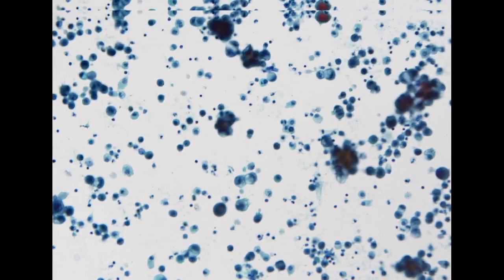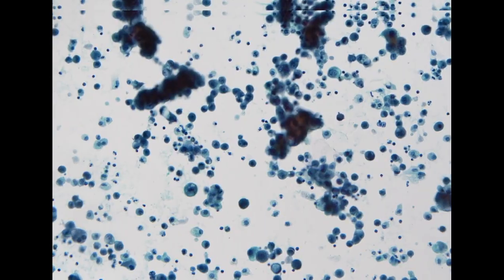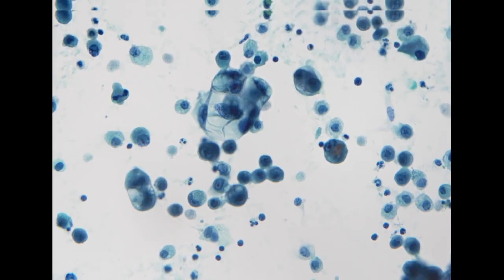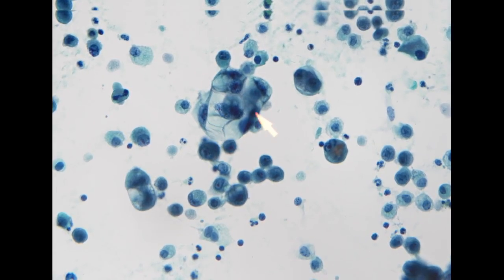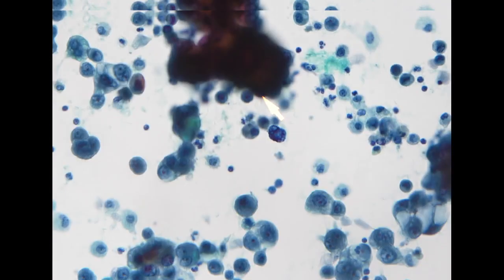So this is a case from a 69-year-old female, and she does have a history of lung adenocarcinoma, and we've already proved that in the pleural effusion specimen, it is positive for TTF1. So here, a typical morphological pattern for lung adenocarcinoma: tight aggregates of cells and highly atypical nuclei. Sometimes you will see cytoplasmic vacuolization. So this is positive.